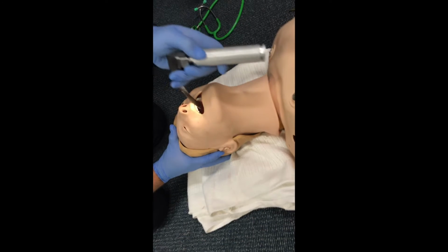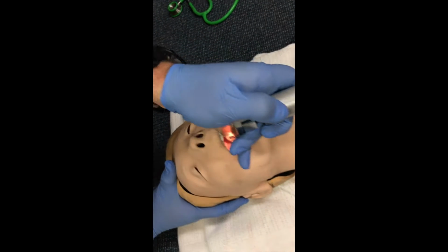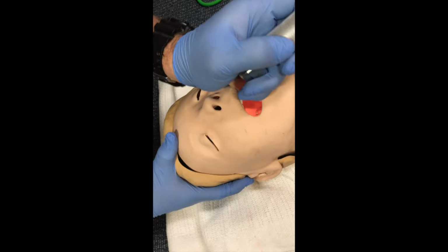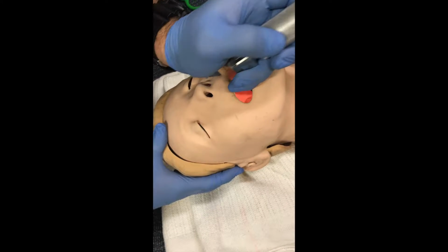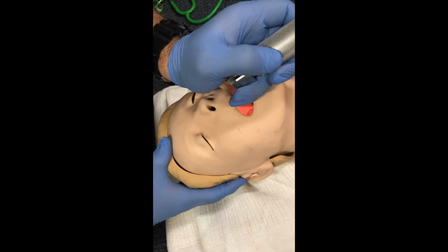Advance the blade to the vallecular groove. Once here, advance the handle up to the imaginary point where the wall and the roof meet in the corner of the room until the cords are sighted.